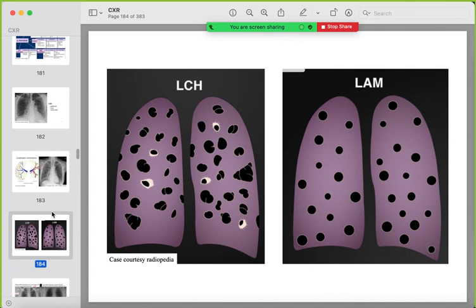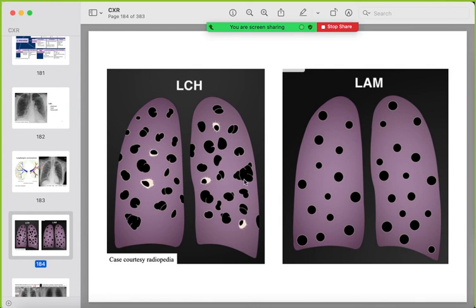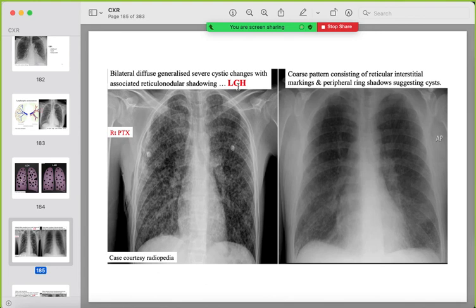Cystic lung disease causes: Langerhans cell histiocytosis and lymphangioleiomyomatosis (LAM). LAM is a purely cystic disease with evenly distributed similar-appearing cysts. Langerhans cell histiocytosis occurs in smokers — it is a nodular disease where nodules cavitate and form bizarre-shaped cysts of variable size, so there are both nodular and cystic changes, not uniformly distributed.